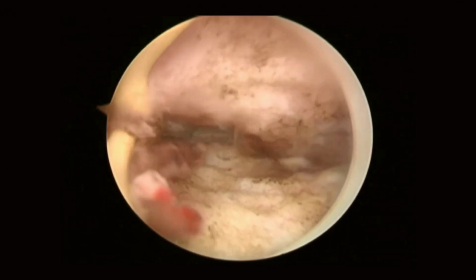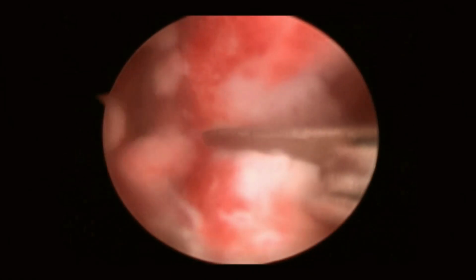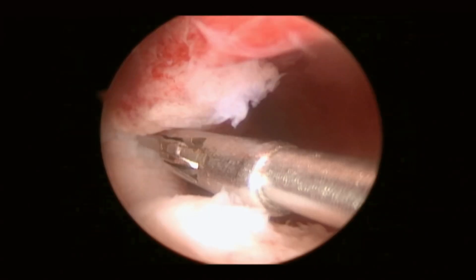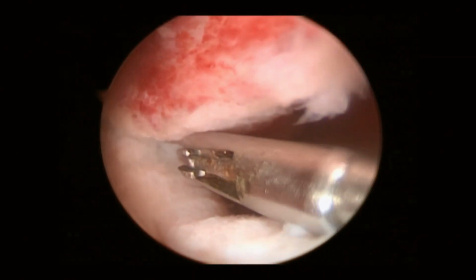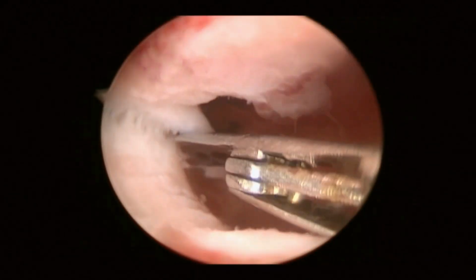Now once you cut the cervical portion, you can proceed with hysteroscopic scissors, and you can cut the rest of the septum from the internal os to the fundus with scissors. Being a broad based thick septum, it is very difficult for scissors to tackle, but just to avoid current, we have to take this pain as a surgeon.